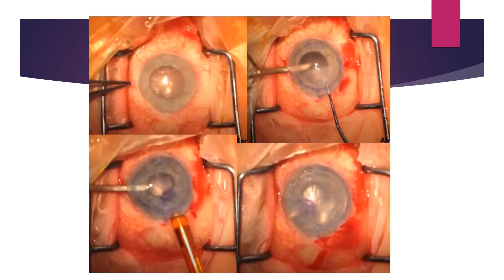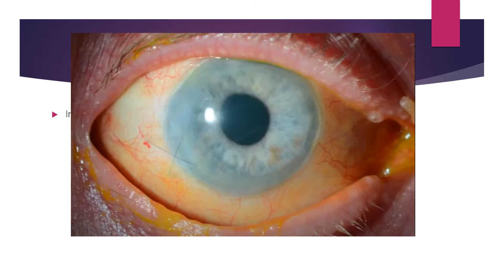This is another case referred to me with several failed previous DSAEKs and a glaucoma tube. I marked with the 9 mm ring for proper centration of the new DSAEK graft. In the top right picture you can see how I am stripping the old failed DSAEK, and the bottom pictures show me inserting and unfolding the graft, floating and centering it into appropriate position. The final picture shows the eye a few weeks after with significant visual recovery and a much clearer cornea.